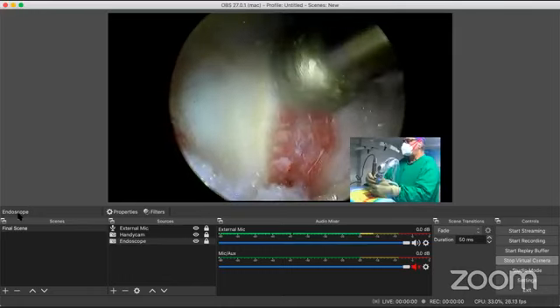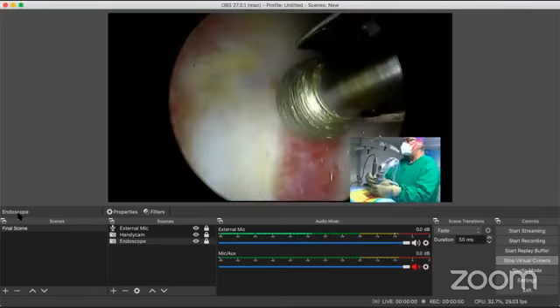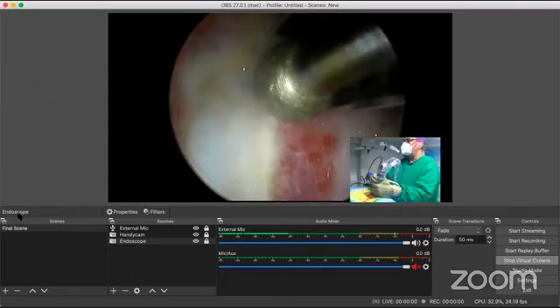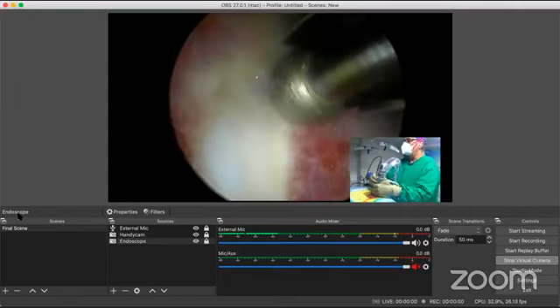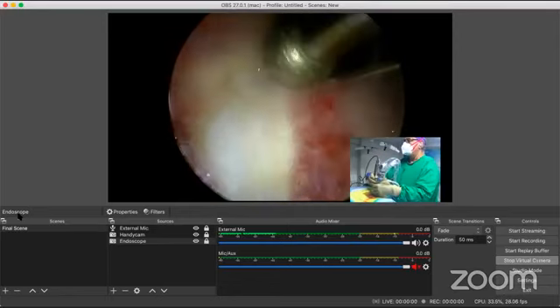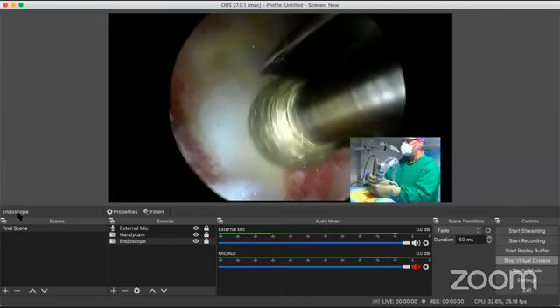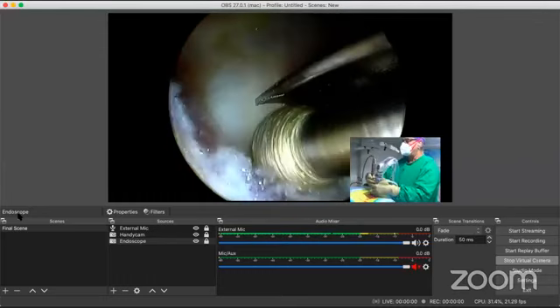I'm burring the lower lamina. And I'm coming up on the laminar edge. See, now the lamina is becoming more and more evident to you. What was not evident is becoming very evident now.